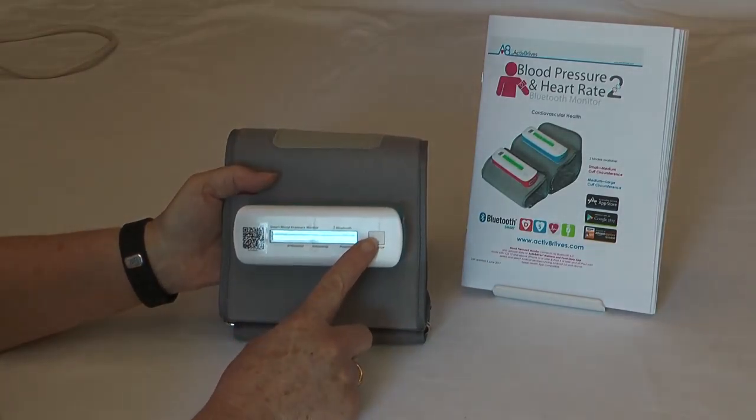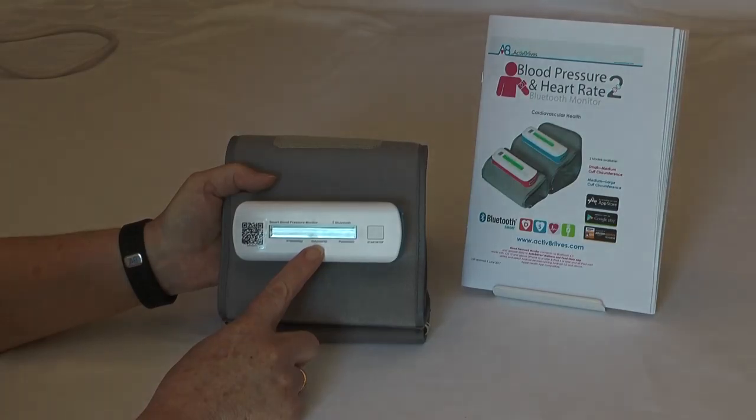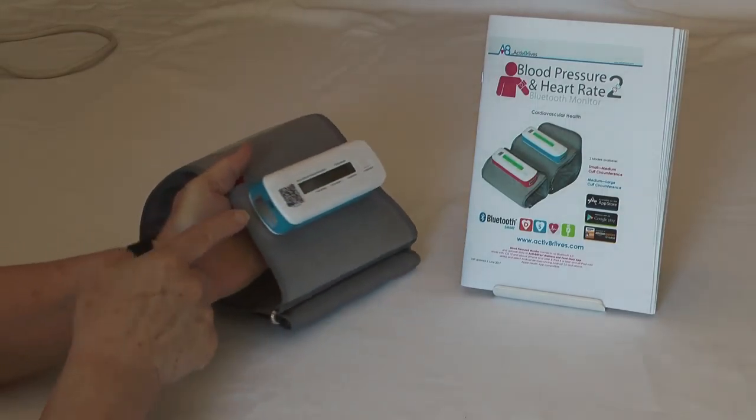It comes with just one button for operation: start-stop. It displays the heart rate, diastolic and systolic, and this is a QR code for identification.